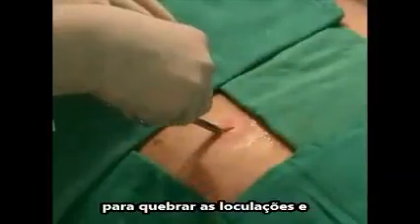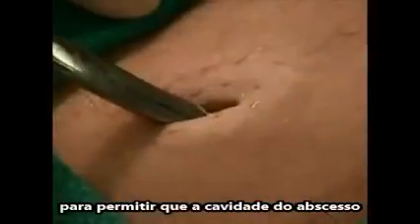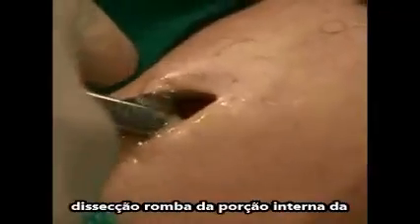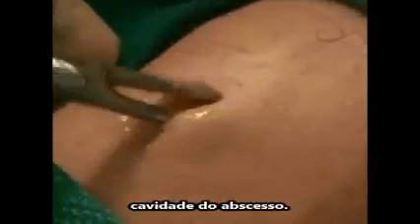Use a curved hemostat for further blunt dissection to break loculations and allow the abscess cavity to be completely opened up. Insert the hemostat into the wound until you feel the resistance of normal tissue, then open the hemostat to perform blunt dissection of the internal portion of the abscess cavity.